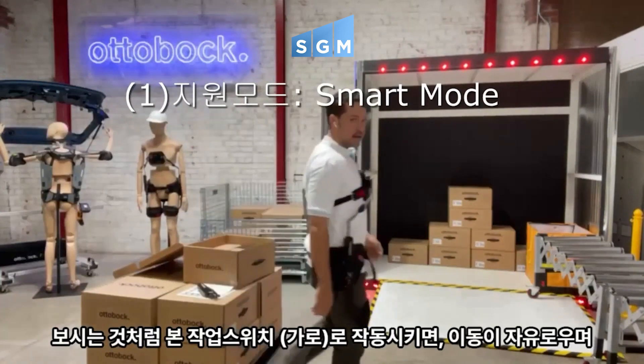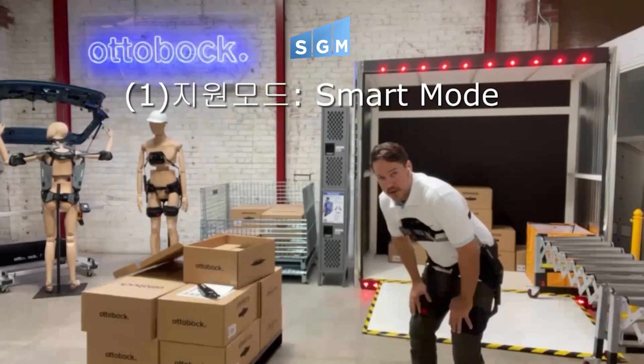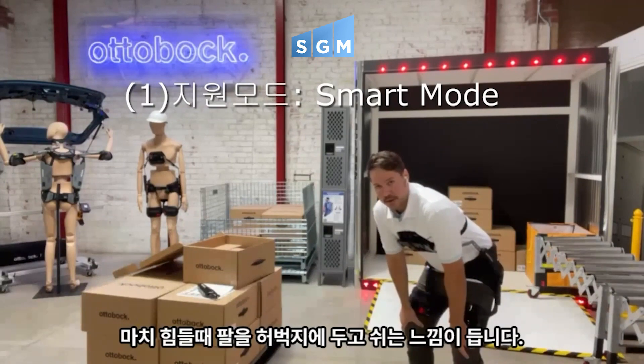I'll move this switch down to turn the unit on. Essentially, it will let me walk around freely. The minute I bend, it's going to put a pressure on my chest and a pressure on my thigh. It feels like you're resting your arms on your legs when you're bending over.